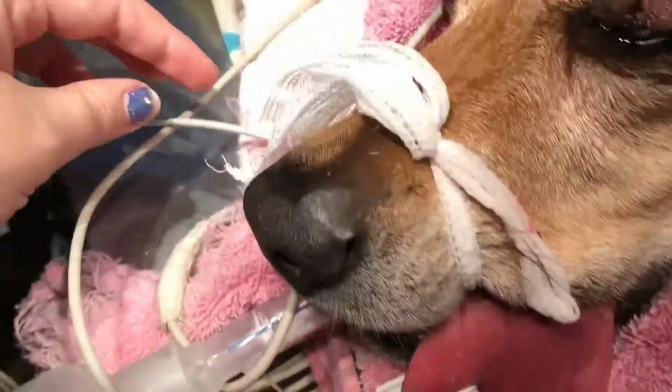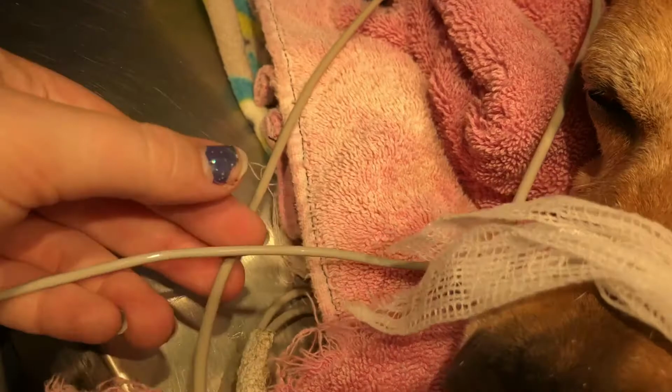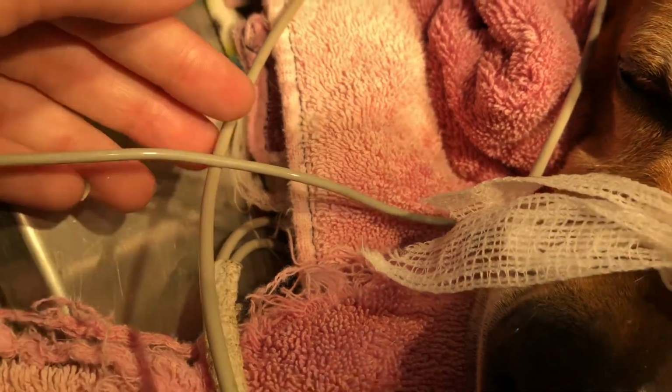Another machine that we like to use is a thermometer. A big thing that can happen with patients under anesthesia is that they will become hypothermic. So using a thermometer, we monitor the body temp and we try to make sure they don't become hypothermic. On our machine in my video, you can see that we are using an oral thermometer, but we also intermittently use handheld thermometers and insert them rectally into patients while we're doing our anesthesia. Our ideal temperature is around 99 to 100 degrees. If it gets under 98, you want to notify the doctor.